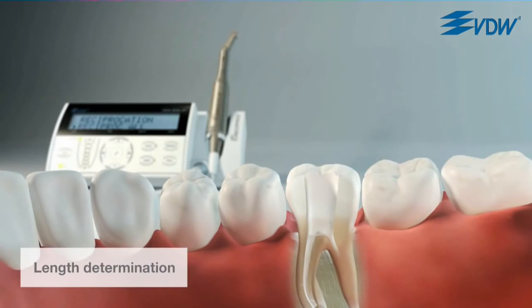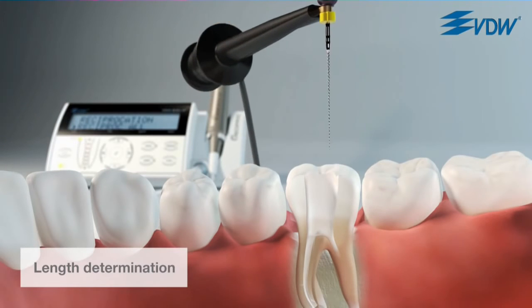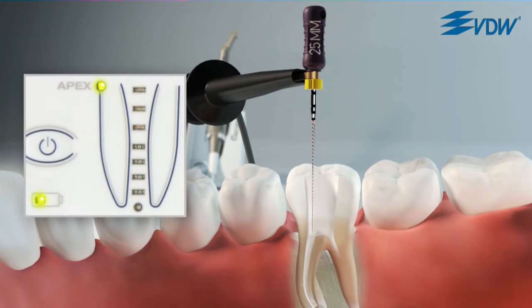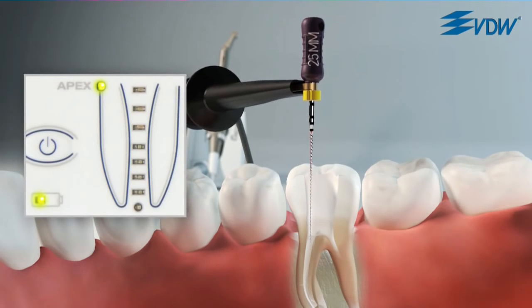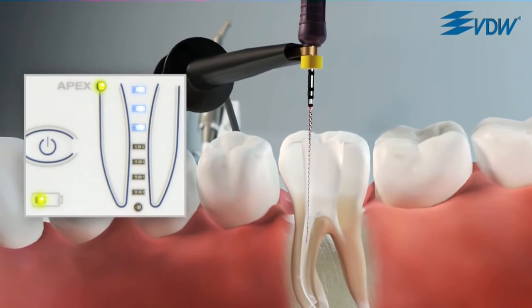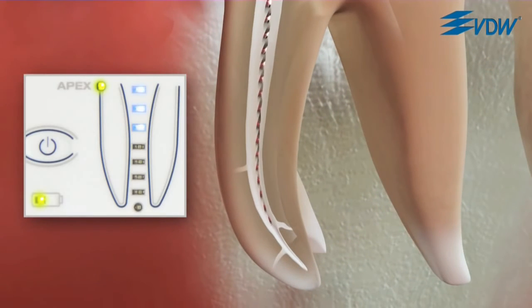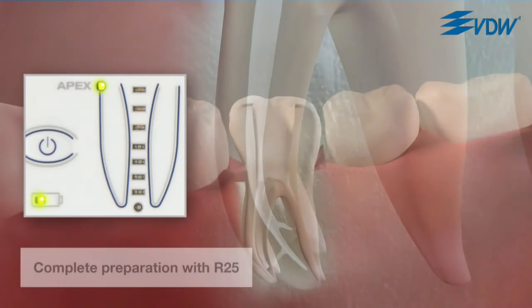Working length is now determined electronically with the help of a VDW Gold Reciproc. A C-Pilot file size ISO 10 is used both to measure the length of the root canal and to give an indication of the curvature of the canal. Make sure that the instrument is not pre-curved. Only a straight instrument will give reliable feedback about the difficulty of the apical region. Working length is reached when the third green diode illuminates. If the file goes to full working length, preparation can be completed with the Reciproc instrument.